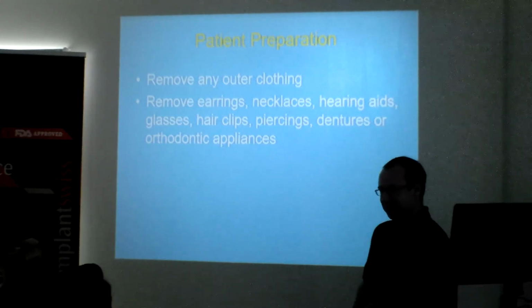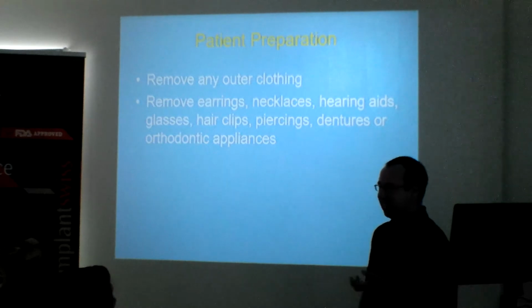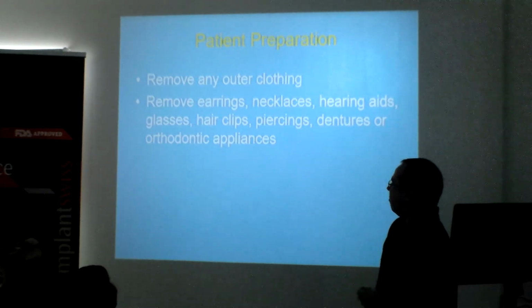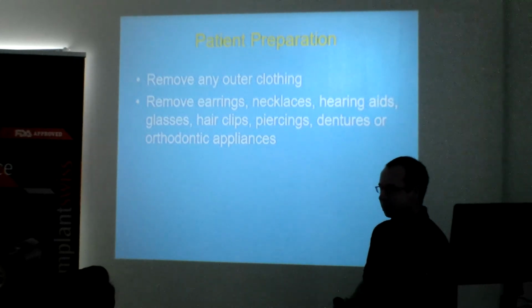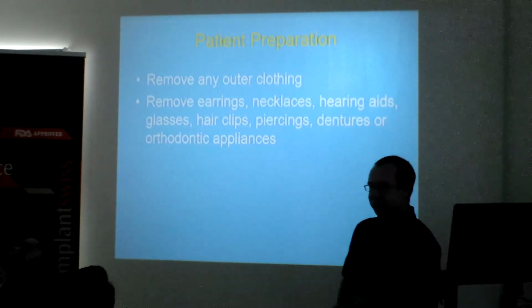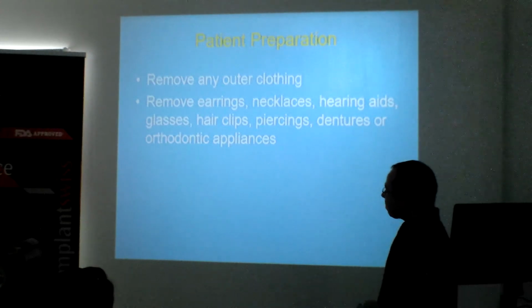The other one is piercing as well. We've had to get pliers before to prize these things out because they don't take them out and they're really manky to look at. Hair clips, hair extensions. No, haven't got any. You look at the scan, they're there. You have to be very, very careful. Hearing aids as well, we tend to just get those out at the last possible minute so the patients can still hear us as well.